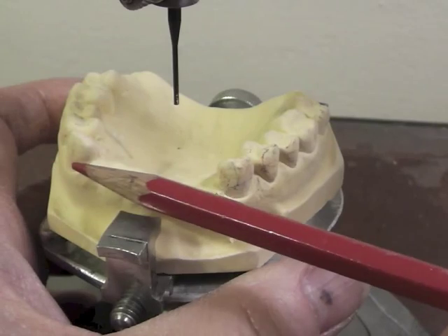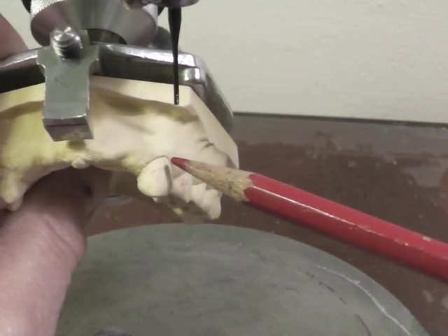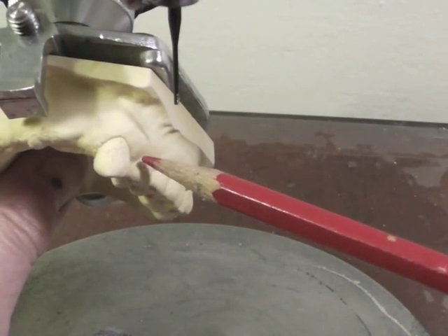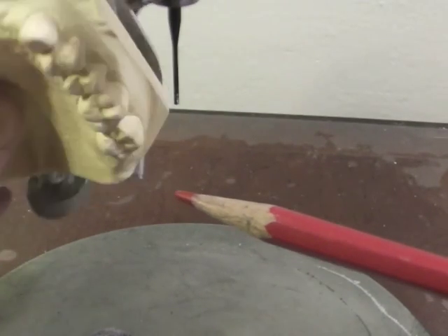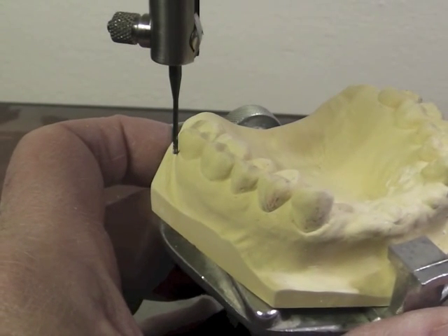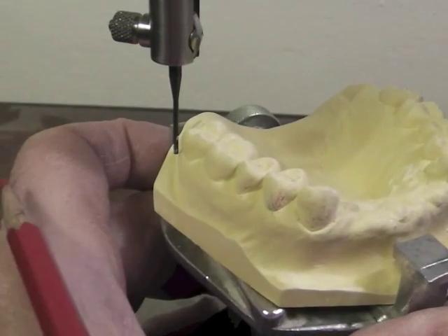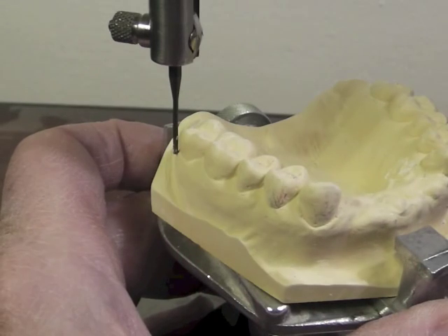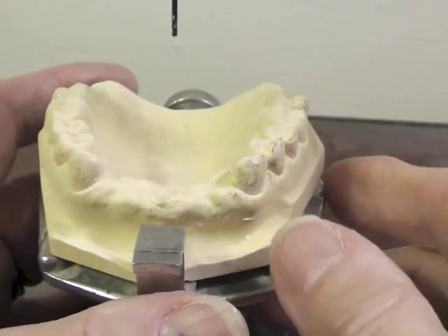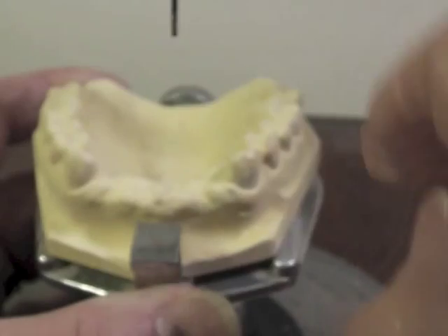I really don't want an undercut on the mesial facial of the canines. I'll probably want one more on my premolars because if this is a maxillary RPD, two arms coming across these canines would not be extremely aesthetic for our patient. We'd be better off going back a tooth to the first premolar from an aesthetic standpoint. Looking at the molar on the other side, I do have that triangular space of light. I have a slight undercut on that molar, but a much greater one on this molar. I can improve the survey by tipping the cast slightly to the left, which would make one undercut smaller and the other larger.